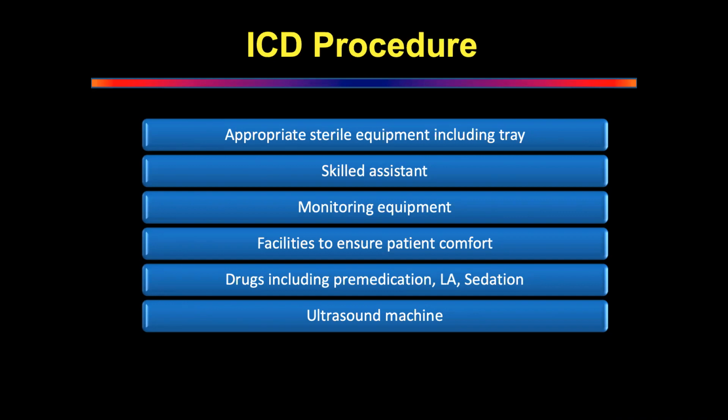Don't do this in your country. Whatever countries you are in, you may not do it. But if you're going for the FRCS exam, you have to go by NICE guidelines, and NICE guidelines say you should not put in chest drains without ultrasound. So you have to make sure that an ultrasound machine is available, and more importantly, that you know how to use it yourself.